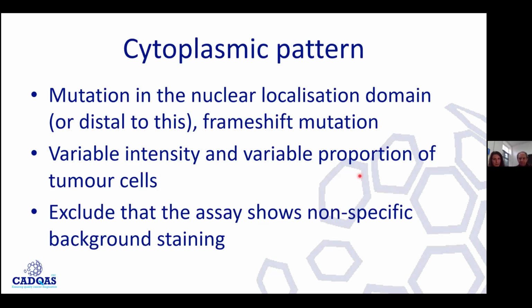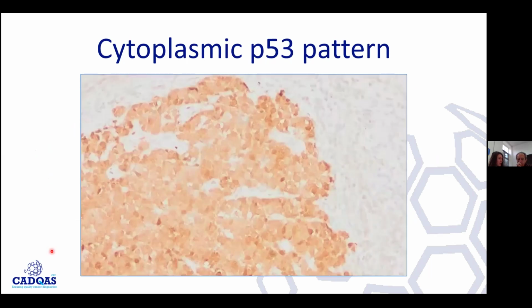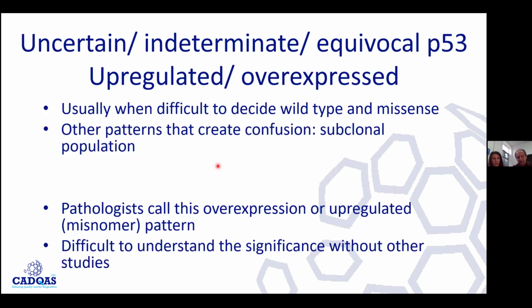Again, it's not a specific mutation, especially for these other two patterns. And what we need to make sure is that the background does not stain, because if we see cytoplasmic staining in the tumor, but then the rest of the tissue is also staining, we need to have this clean. Clearly, yes.